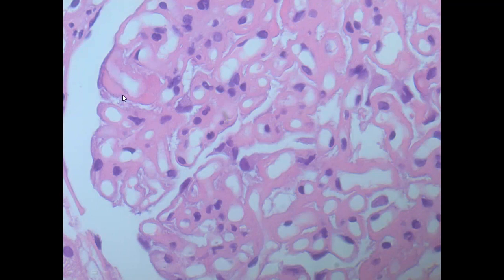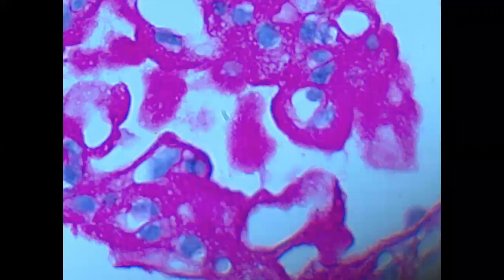So you get a suspicion whether I'm dealing with lupus, because in lupus class 5 membranous you are going to see non-uniform thickening of the glomerular capillary basement membrane or glomerular capillary wall. If you find a uniformly thickened glomerular capillary wall, it is more consistent with primary. If you find non-uniform thickening of the membrane, it is more consistent with secondary. But these are not foolproof evidence. You need to do immunofluorescence to demonstrate.